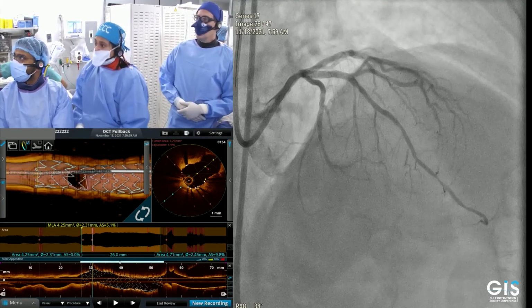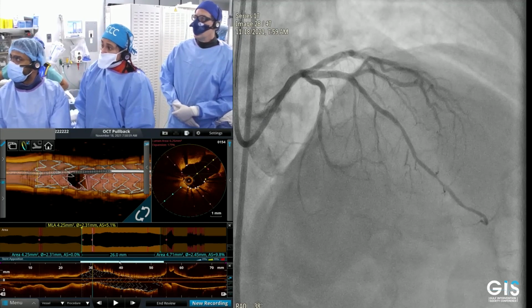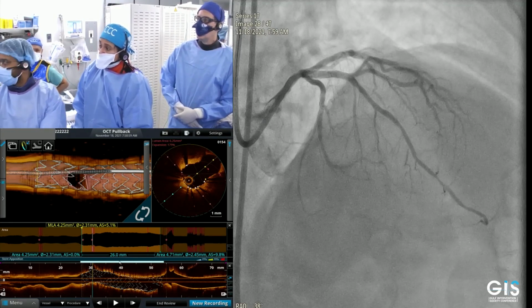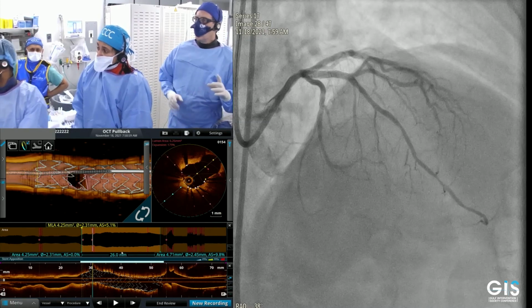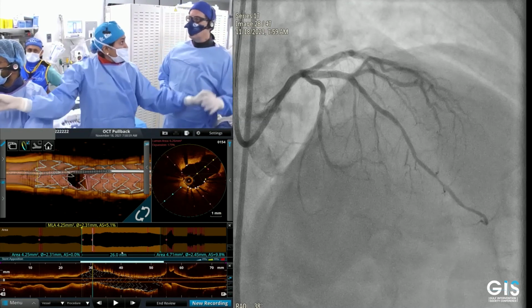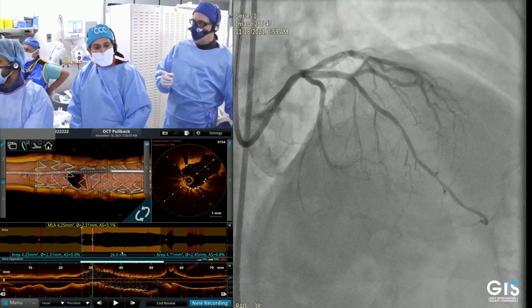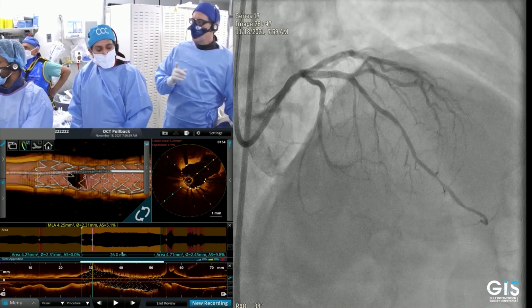Just about stent sizing, do you usually size the stent regarding the intima, I mean lumen diameter, versus the medial diameter from media to media? We size to the media to media diameter of the distal, which is pretty much the same as the lumen of the proximal.